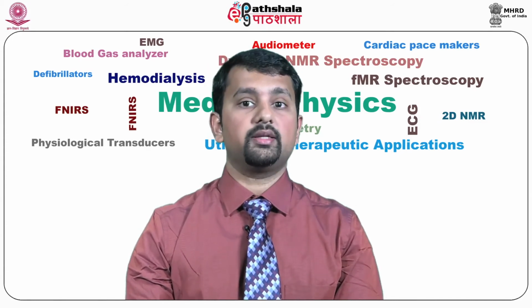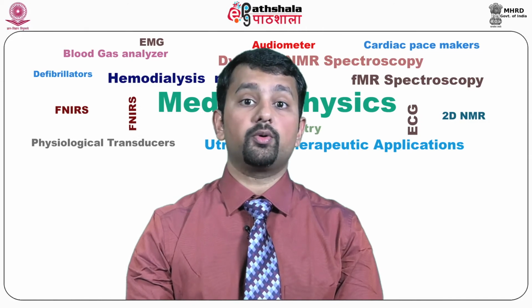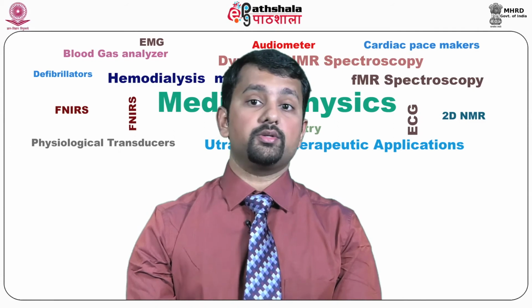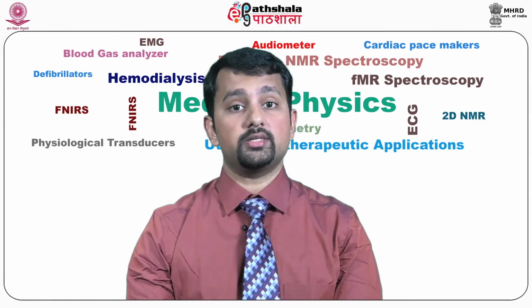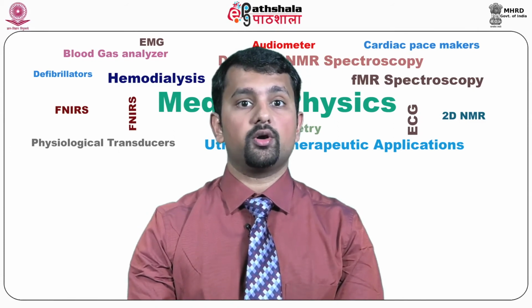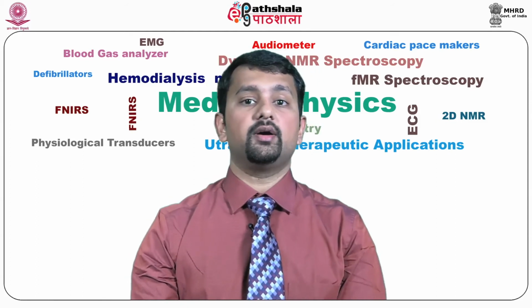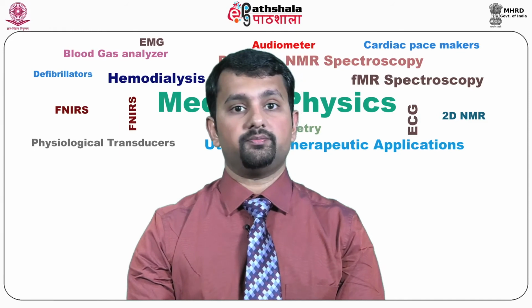It is observed that changes in choline levels could provide a biochemical marker of clinical response as soon as 24 hours after the first dose of doxorubicin based chemotherapy for locally aggressive advanced breast cancer.